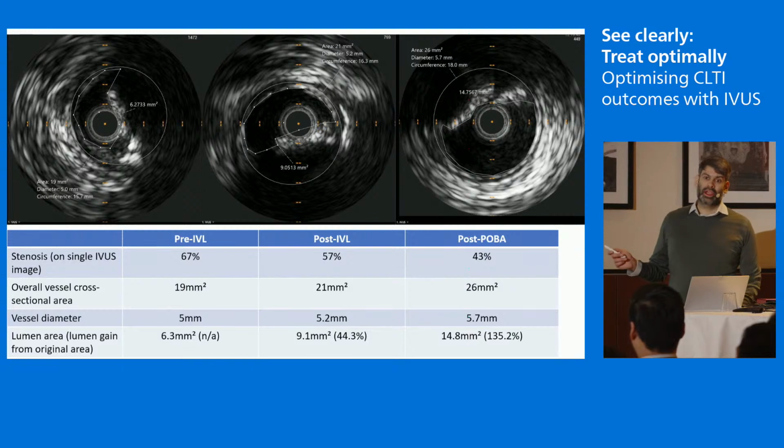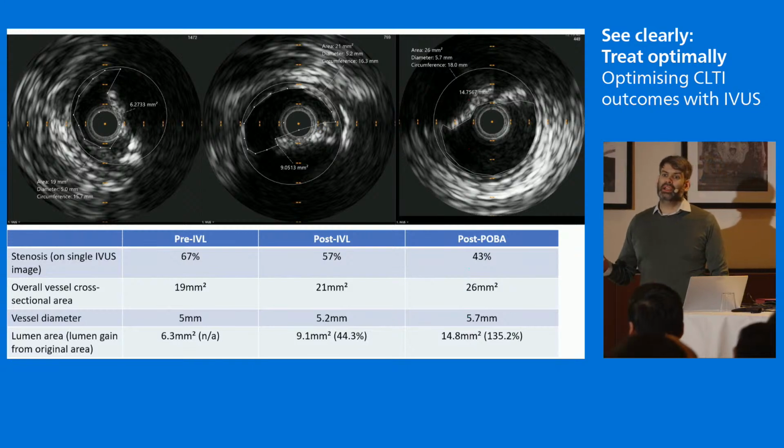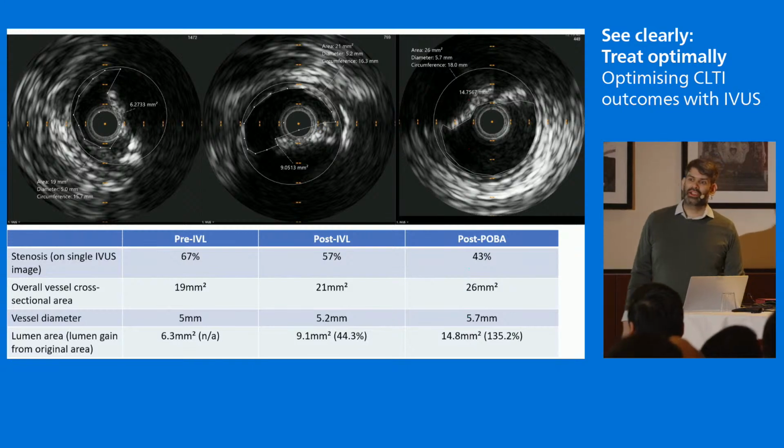That's something we see on pictures. What does that mean in practice? Well, in practice, that changes a vessel that might just have a monophasic flow or a weak pulse to a really good, strong pulse with a biphasic waveform, if you've got the ability for that media to suddenly open and snap back.